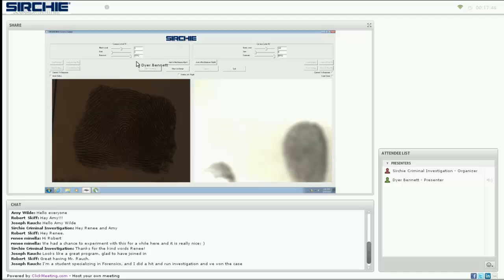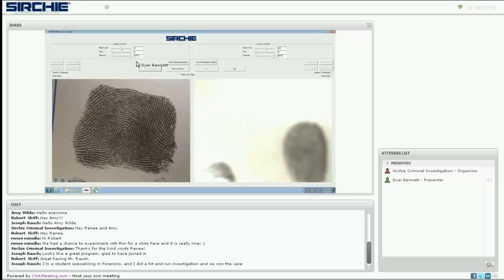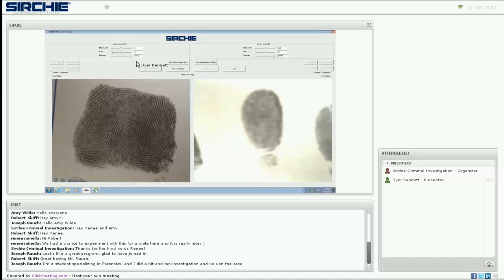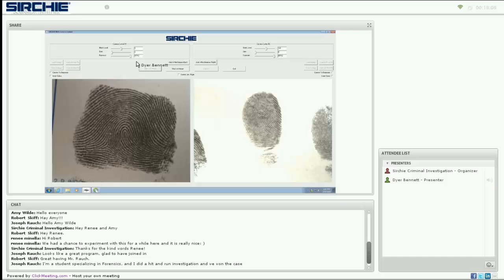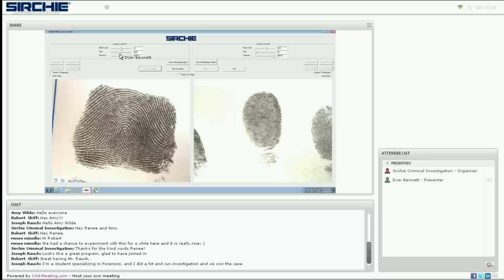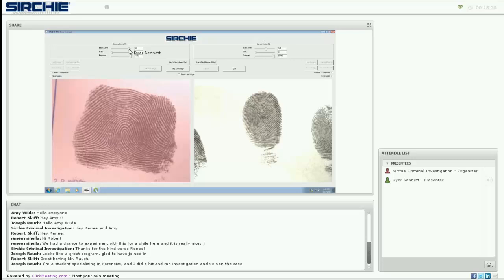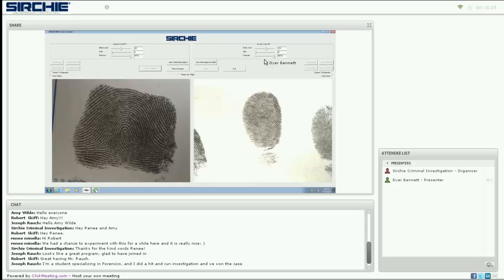On the left we have an image taken from a 10-print card, and on the right we have an image of a latent print. Looking at some controls: on each window we can control gain, which is like the electronic aperture of each camera — as gain increases, the light increases. We can also increase the black level, which is more of a contrast control, and we can reduce or increase exposure, though exposure has less effect when working with static images.